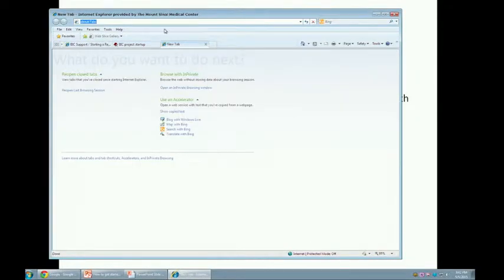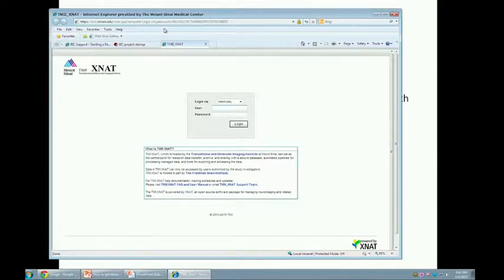However, if you want, we also have facilities to process the data further, which you can also access from XNAT. Chen has set up a reference for how to, for example, start the functional preprocessing or the anatomical preprocessing. And the last bit that we're constructing right now, which should be available soon, is a web-based interface to get the preprocessed data. So the raw data you can get right now, and there's already a system to initiate preprocessing of the data, to remove artifacts and to normalize spatially to get all the brains into a standard space. The last bit that we're building right now is the downloading mechanism for the preprocessed data. So we're going for a no gatekeeper model.